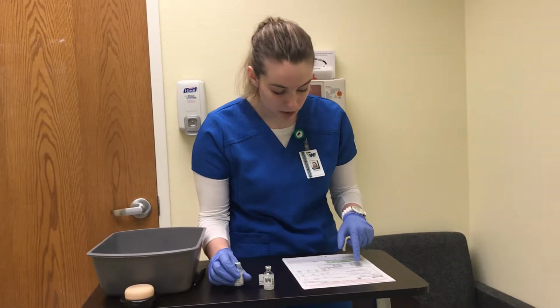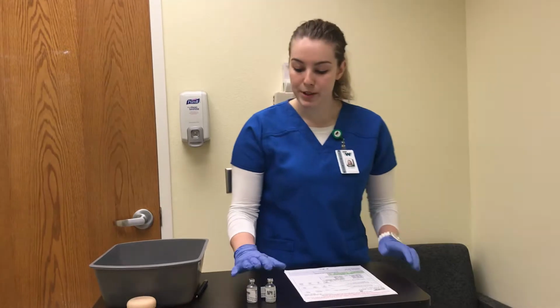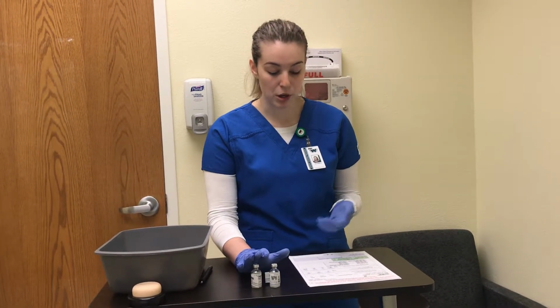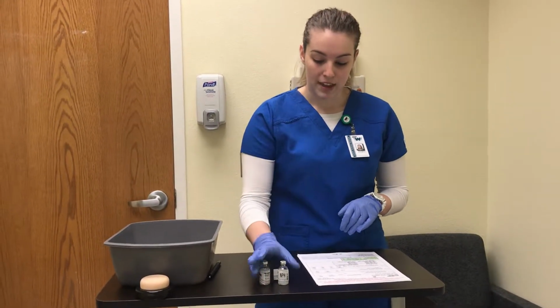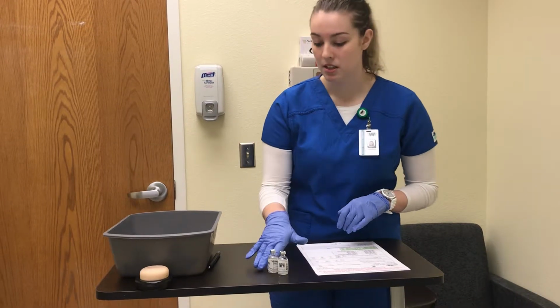And I know I need 10 units of this. So these two insulins we already know can be mixed together, so you can only give one injection instead of two. And for that, the onset is 30 to 90 minutes.